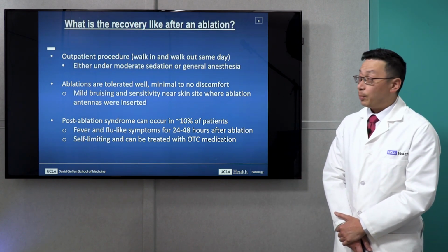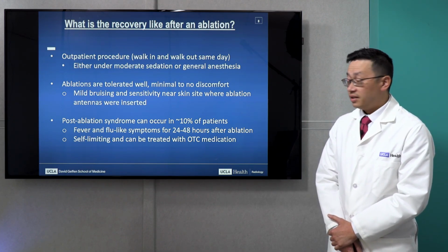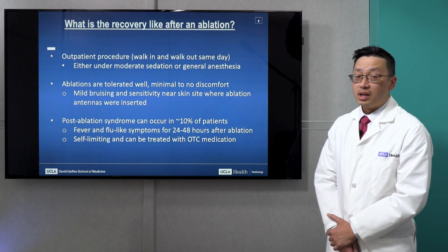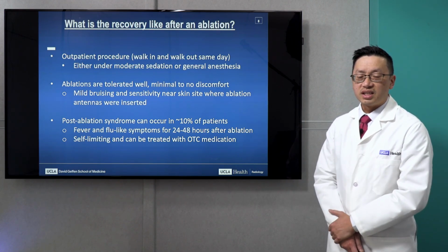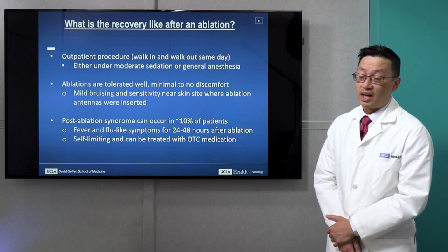This is, again, an outpatient procedure, so people can walk in and go home the same day after the procedure. This can be done under either moderate sedation or general anesthesia. Microwave ablations are generally tolerated very well with minimal to no discomfort. There may be some mild bruising or skin sensitivity where the needles have been placed through the skin into the liver, but those usually resolve in a few days.